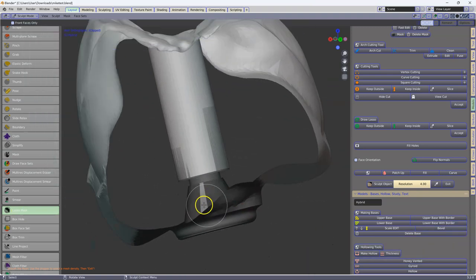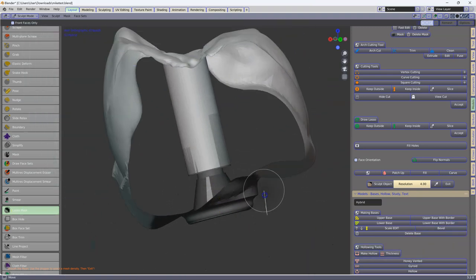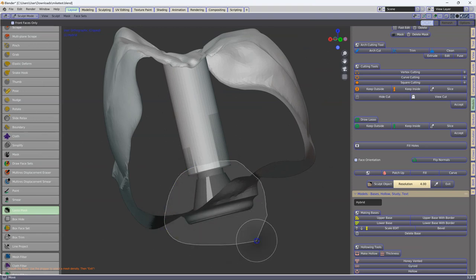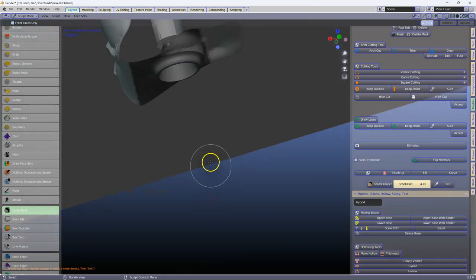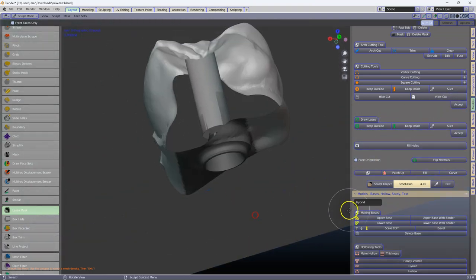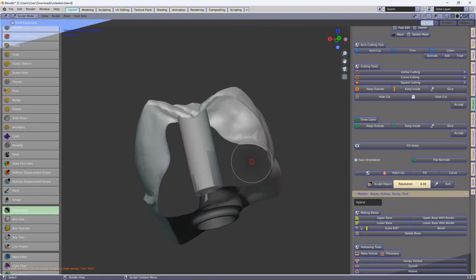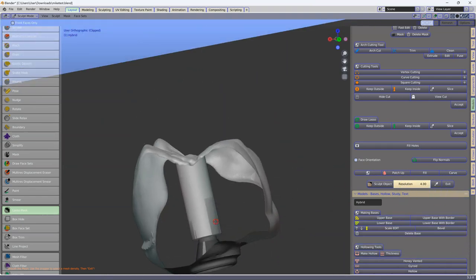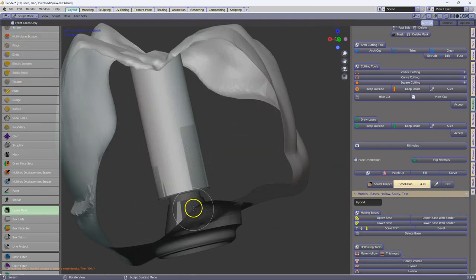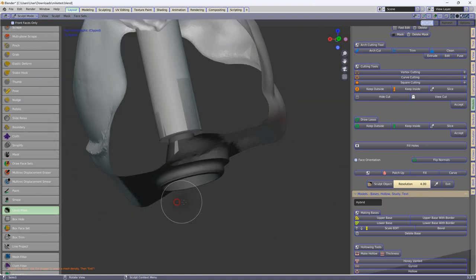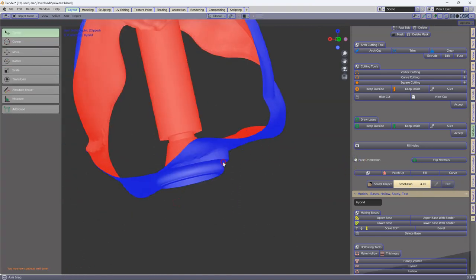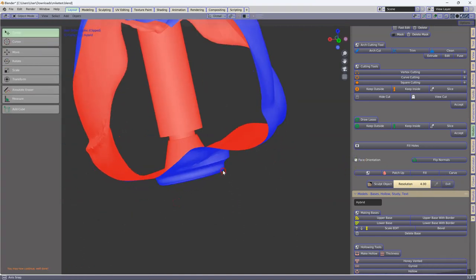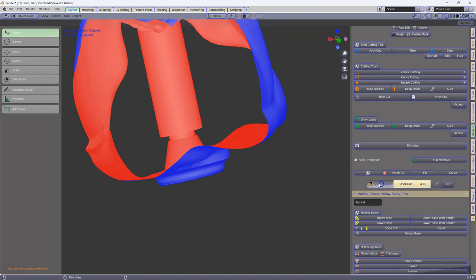We can see over here, there's something going on, which is less desirable. Perhaps there are vertices or something which are not correct. Let's have a look at the face orientation. That seems to be okay.